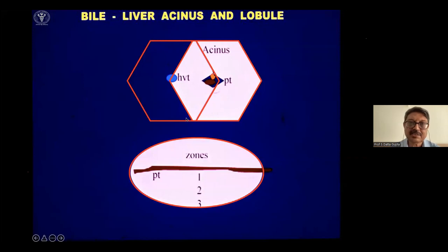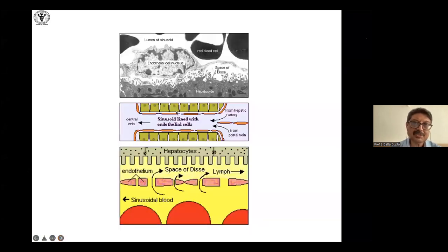Now, if you come to the normal liver, the liver diagrammatically is shown as hexagons. It's not a hexagon. It's almost a continuous tree. And it's peppered with certain areas where you have the tributaries of the terminal hepatic venule and what is called the portal tract or portal triad, right? So we'll go into this.